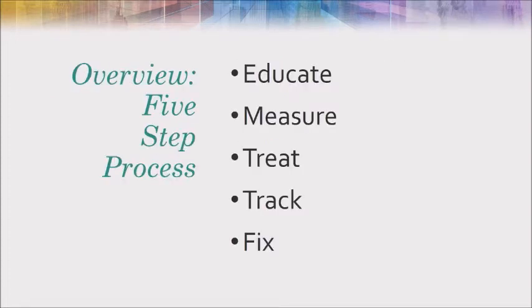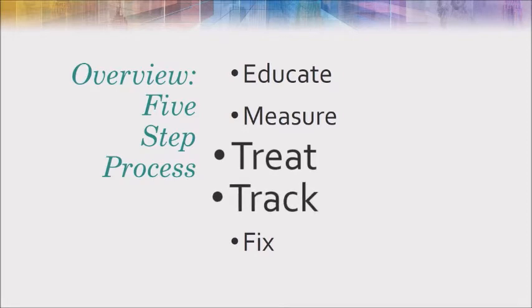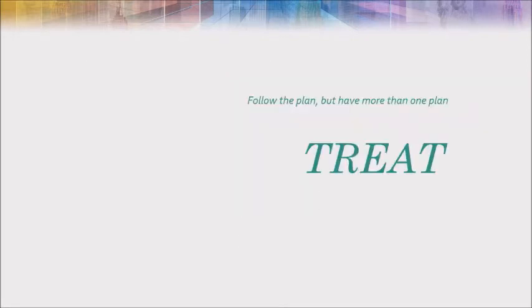And I think this whole session is primarily about a 5-step process that we go through when we're performing refractive cataract surgery. Lisa talked about how we educate, which is our informed consent. We're going to have some of us talk about how we measure. And as a matter of fact, measuring is probably one of the hottest topics that we talk about, which is the topography and the IOL calculation and deciding what to put in the patient. So we set the expectation and we measure and we put all this effort into it, and then we get into the OR. We have to treat, and that's basically what my talk is about today, and then also tracking. So I'm going to talk about those 2 steps in the refractive cataract surgery process.